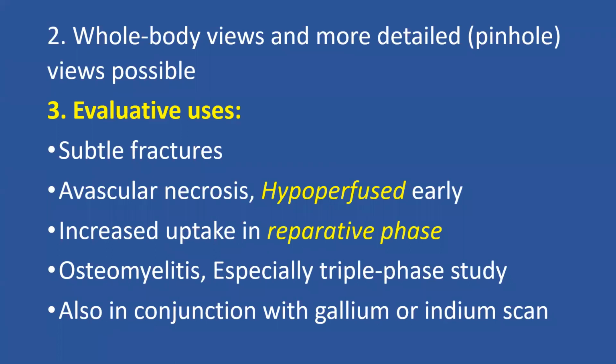It is excellent in detecting osteomyelitis, especially by using the triple phase study. Also in conjunction with gallium and indium scans. These are radioactive substances that we use.